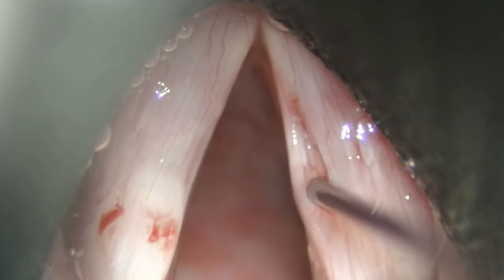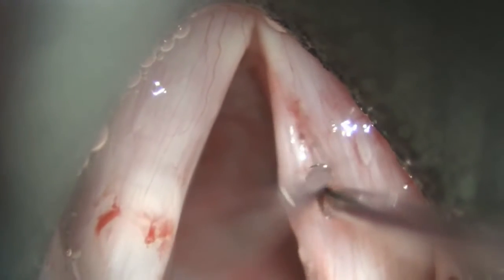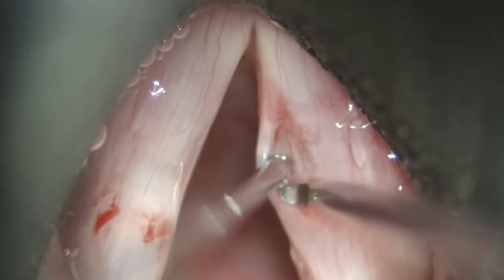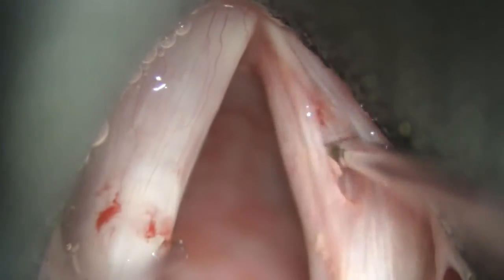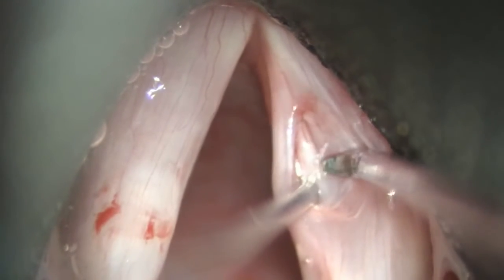As you can see, the flap is very thin. Often the epithelium runs much deeper than you would expect. Sometimes it can be safe to actually elevate while looking at the flap elevator through the epithelium to ensure the epithelium is not violated.